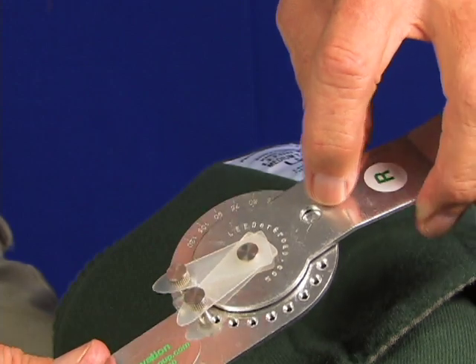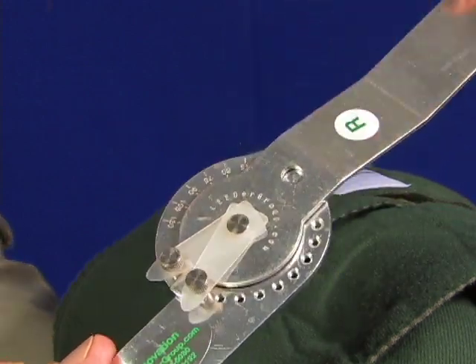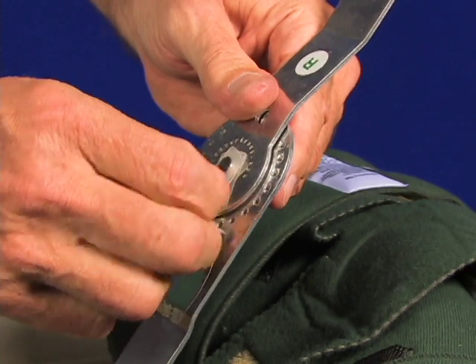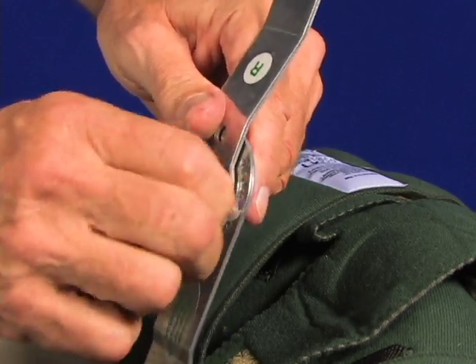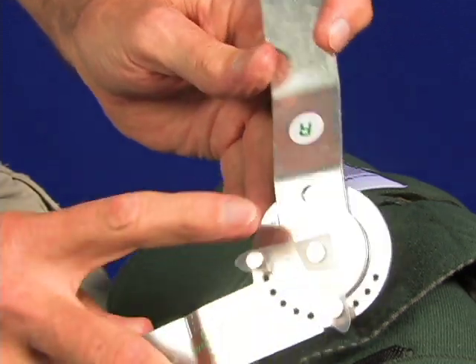You can see the degrees, and there's a degree window that shows you where the pointer is or how the hinge is adjusted. It's locked at this point so that you're fully extended. And you can roll that adjustment back so that you can go through a range of motion of flexion.